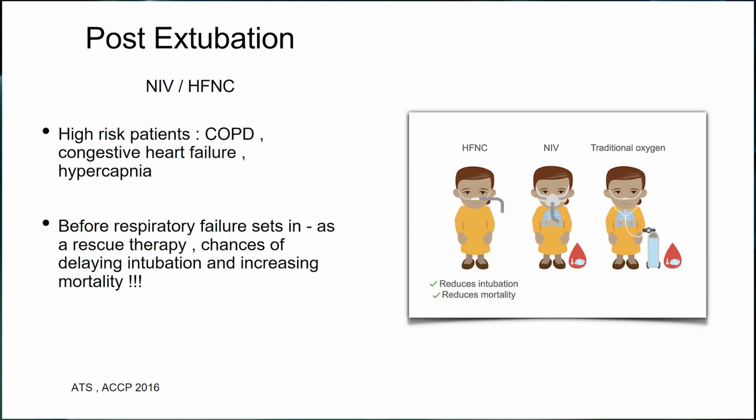The only point we need to remember is if at all you want to give a trial of NIV, then it has to be given before the respiratory failure sets in. If you try to use NIV as a rescue therapy after you extubate the patient, then there is a higher probability that you're going to delay the required reintubation, and that can be associated with poor outcomes.